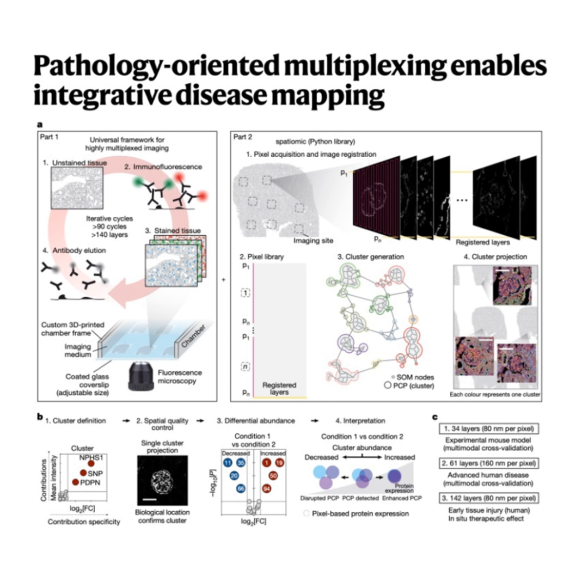What kind of scale are we talking here? How many markers? How sharp is the focus? It's a pretty significant leap. PathoPlex has been optimized to map, get this, over 140 different commercial antibodies. Oh, 140. Yeah, across 95 separate imaging cycles. And the resolution is down to 80 nanometers per pixel, which is incredibly sharp.